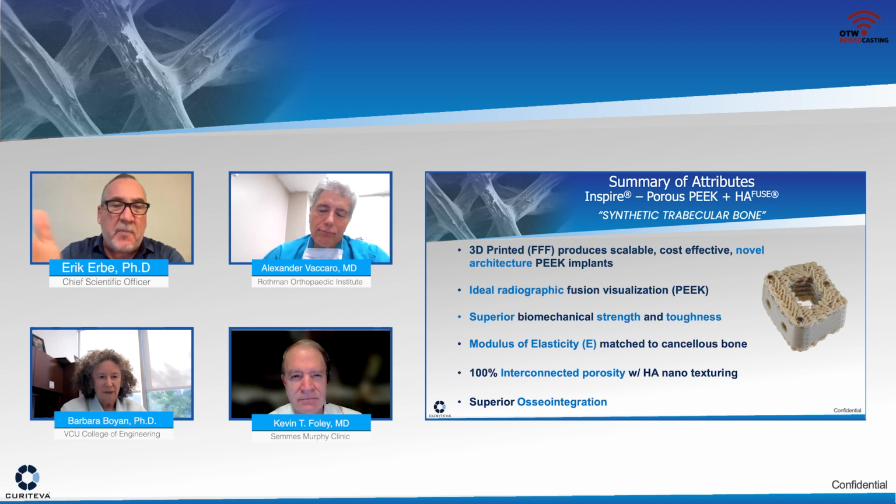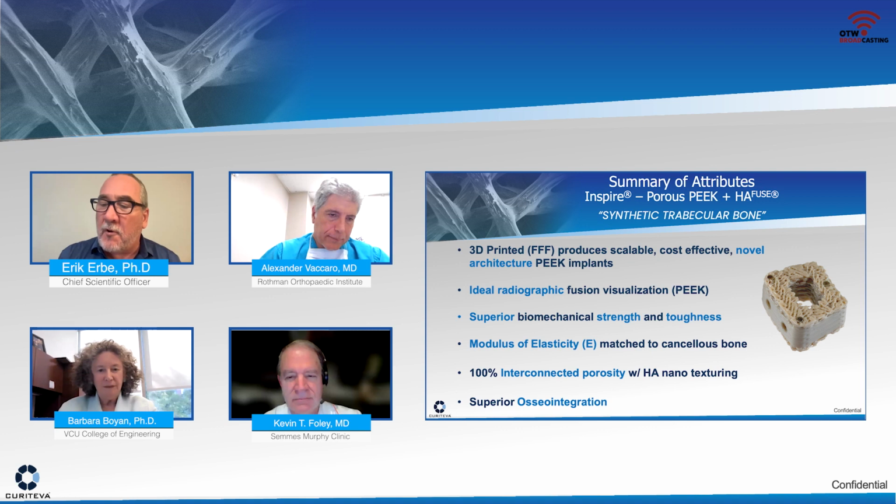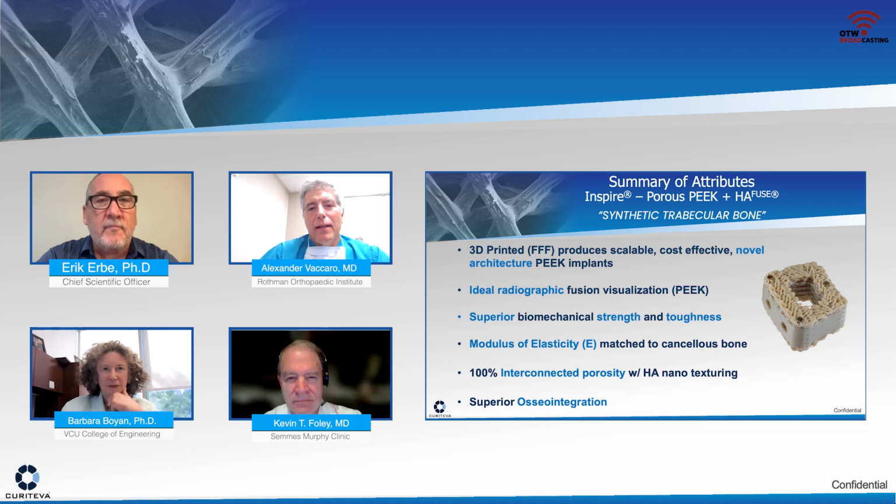My question to the panel is, given your original perceptions about PEEK, what have you heard in this discussion that has changed or altered your perspective, and how do you now think about PEEK or this type of 3D printed porous PEEK going forward? So I've always been a fan of PEEK. I used PEEK in the past in an off-label manner where I placed a bone morphogenic protein within the substance of it. So I used the biomaterial within the cage itself to help me heal. That was an off-label use because BMP has only been approved inside of a tapered metallic cage.